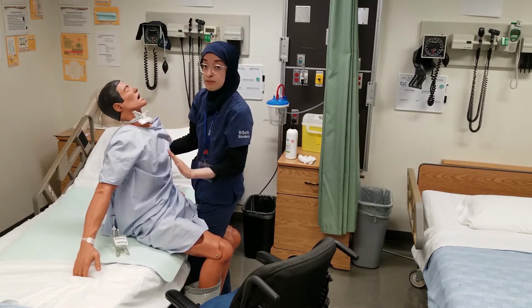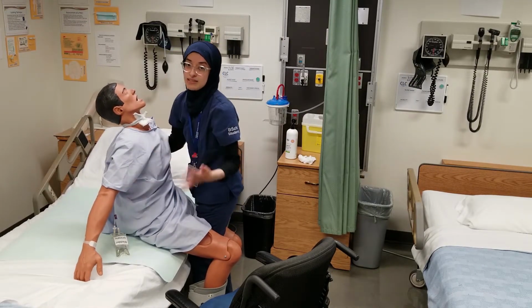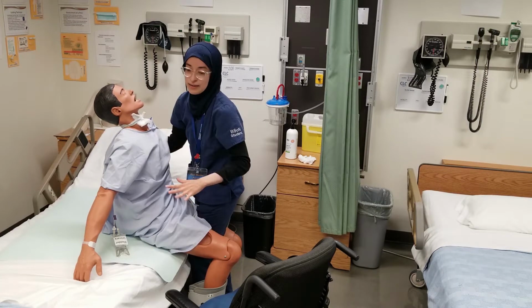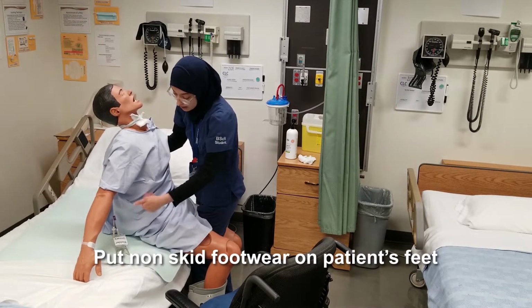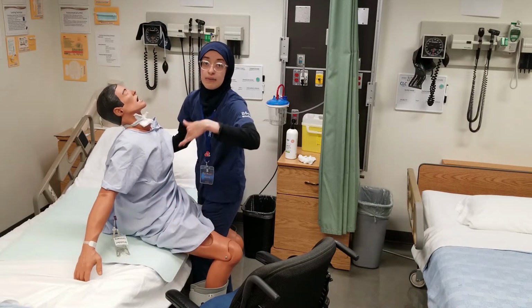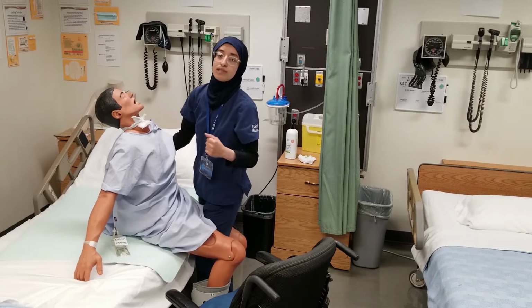So once I confirm that they're not dizzy, I can leave them and grab their non-skid footwear. Again, because this is the mannequin, I can't really let go or else he's going to fall down. So we're going to pretend that I've placed the non-skid footwear on his feet. Then I'm going to ask the patient to shimmy up a bit. That way they're able to move their legs back and I'm not lifting as much. They're able to more so stand up.